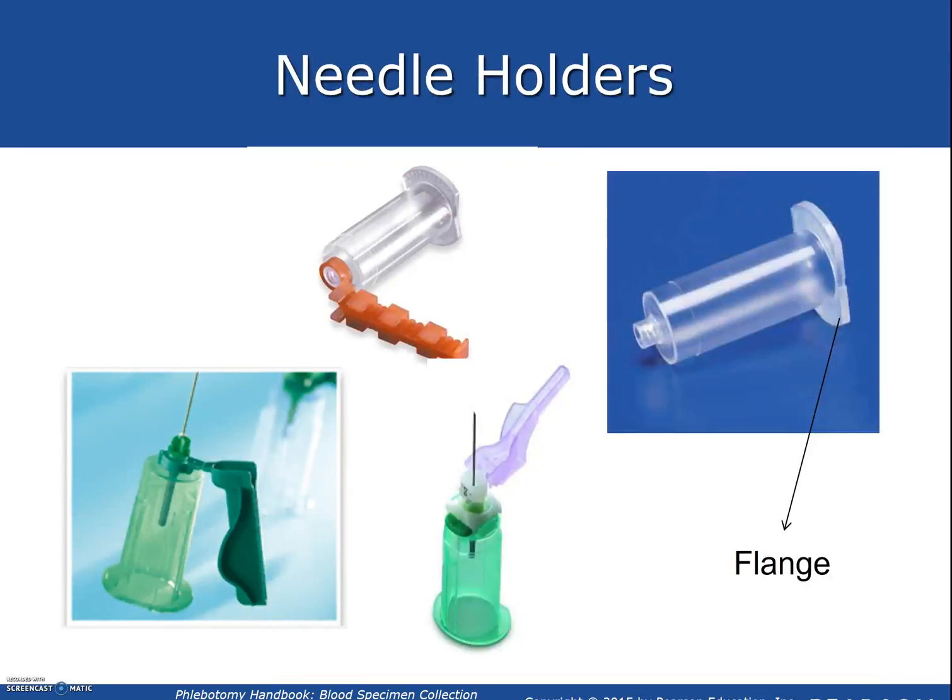These are different types of needle holders. As you can see, they've all changed a little bit. And again, I'm going to reiterate the flange on this piece as well.